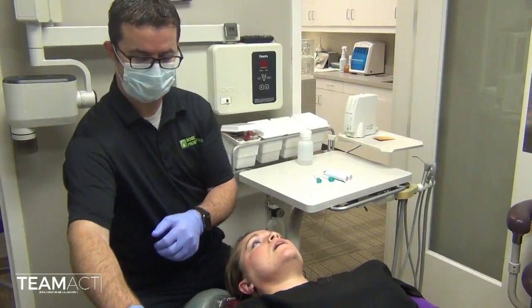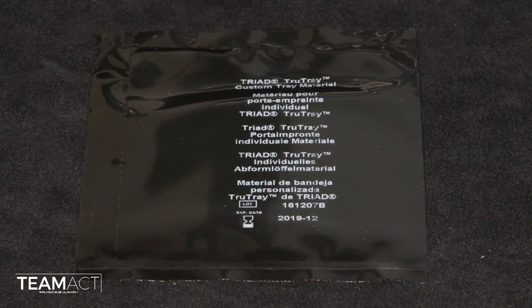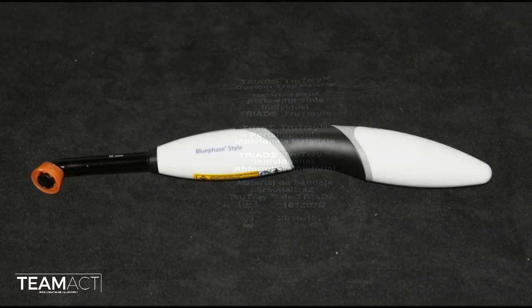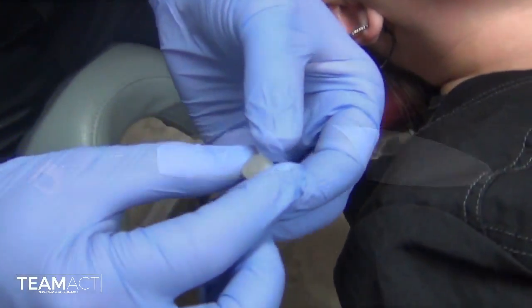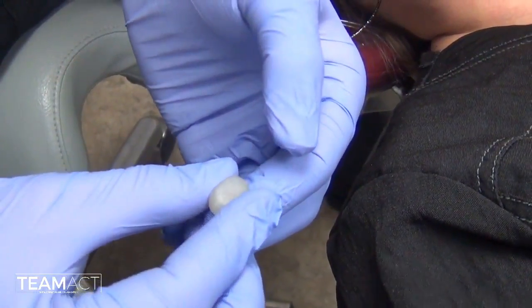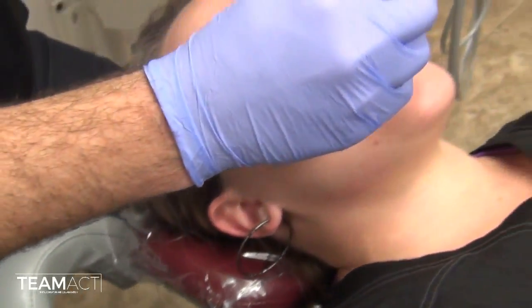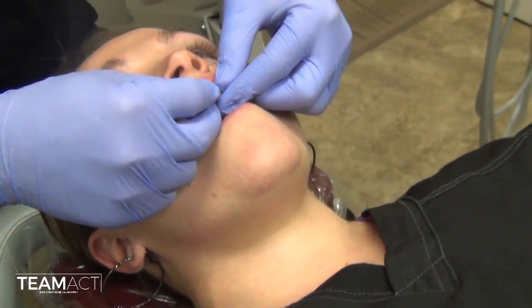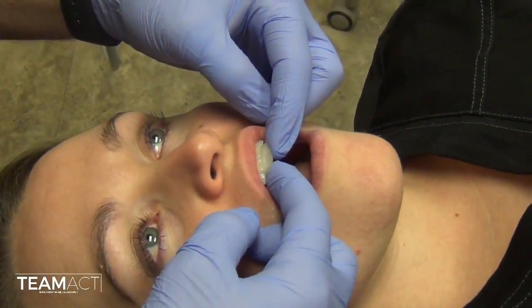We are confident with this case that we found that position. I like to use a little piece of triad tray material to manipulate and close her into that position. I make a little bead of triad and place that over her central incisors onto the lingual and lightly over the occlusal buccal surface.